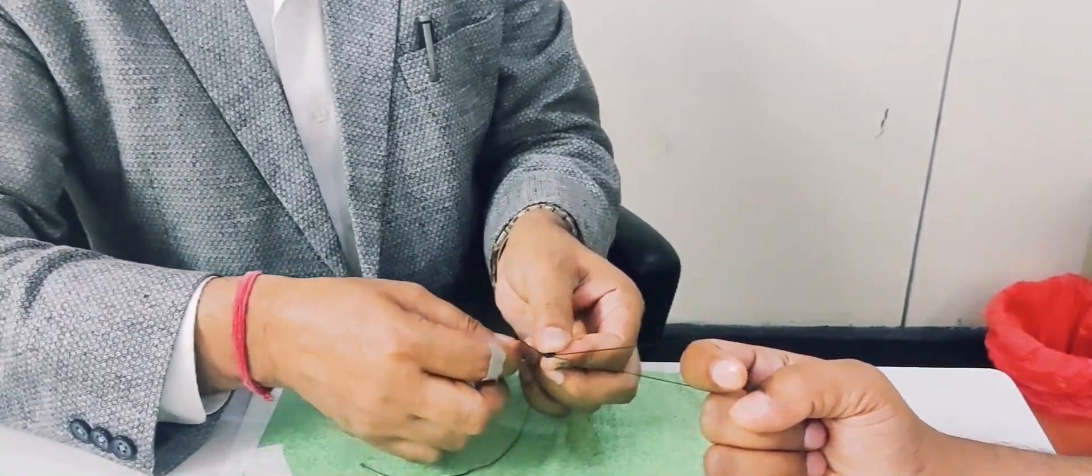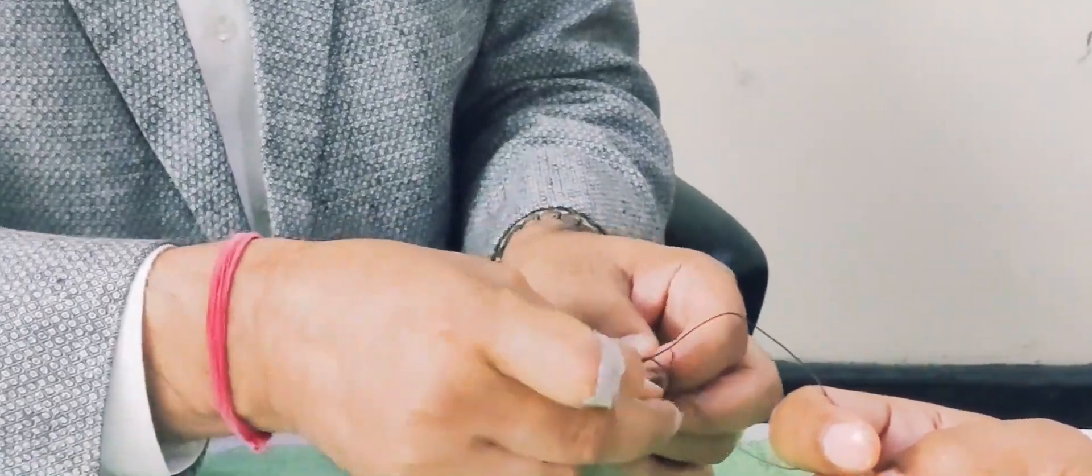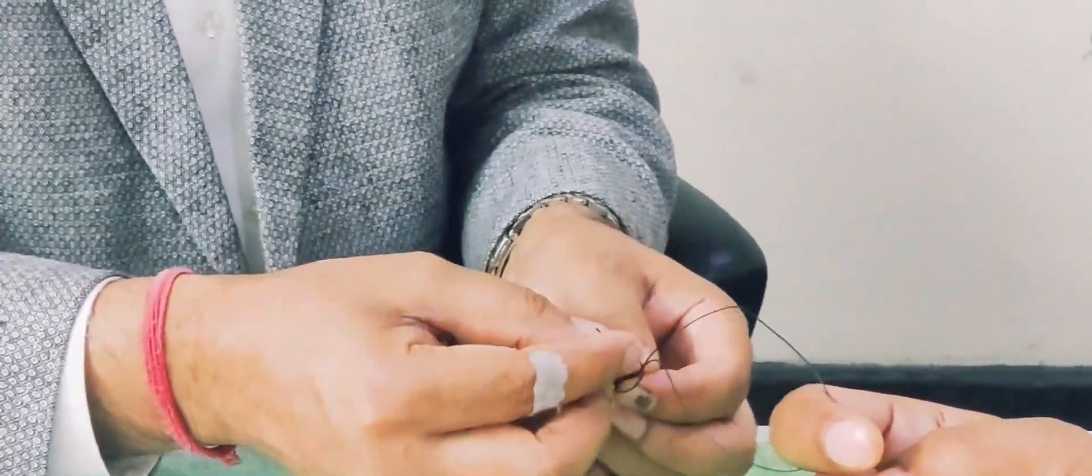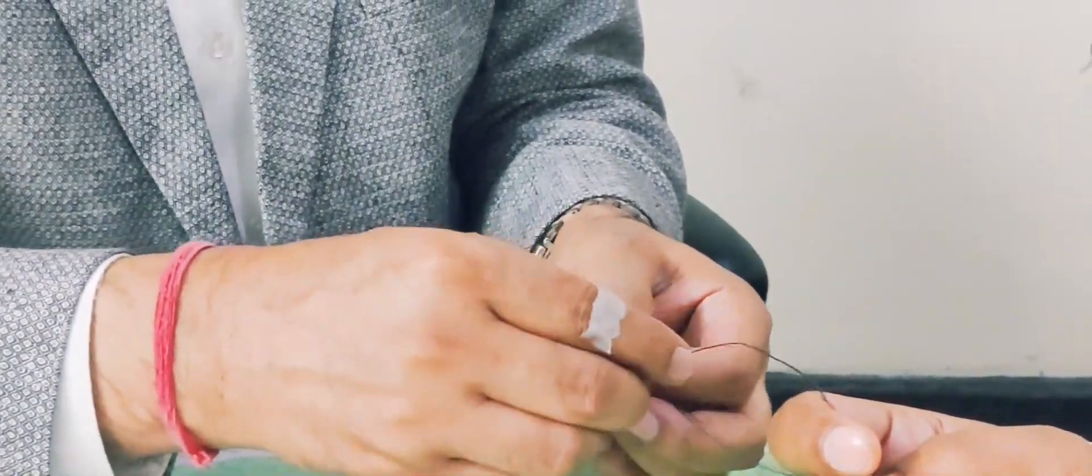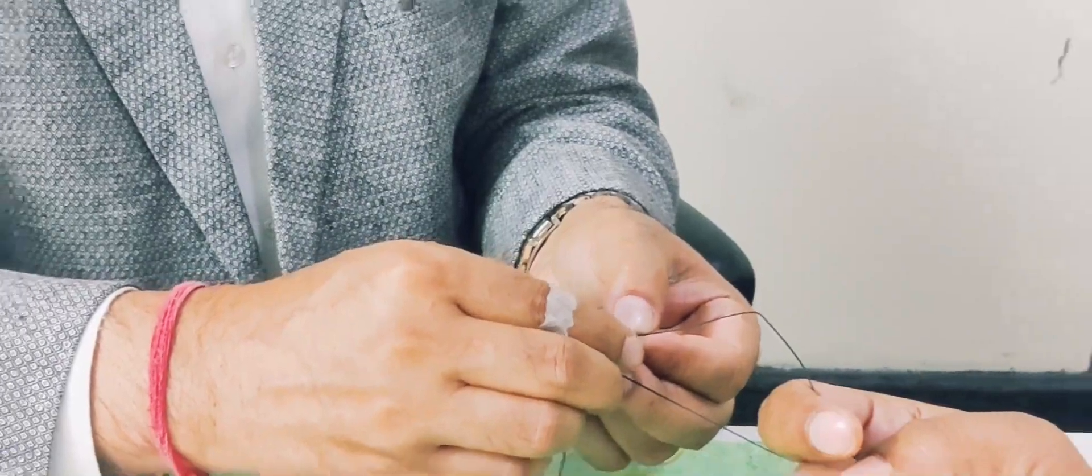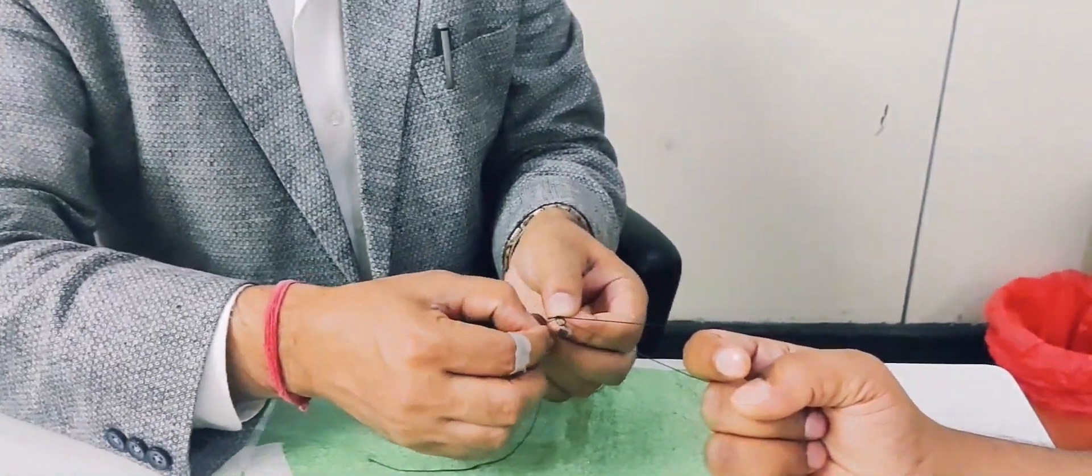And after this, this will be the last full loop. And after that last full loop, there will be a last half knot. So you can see there are three half knots and there are three full loops.